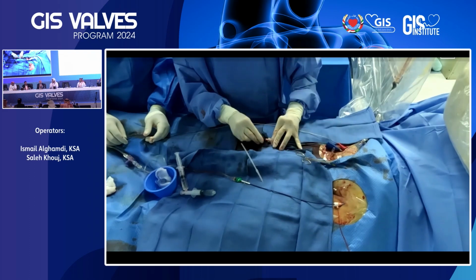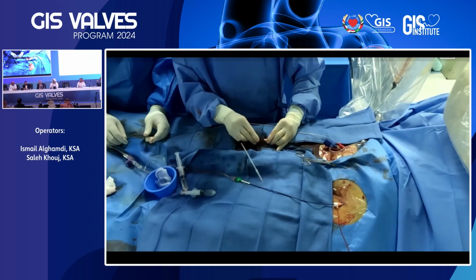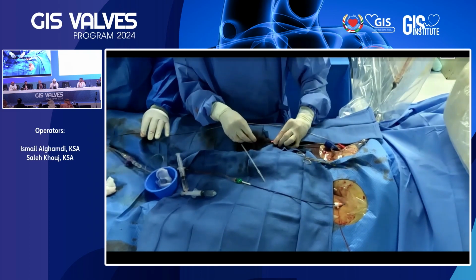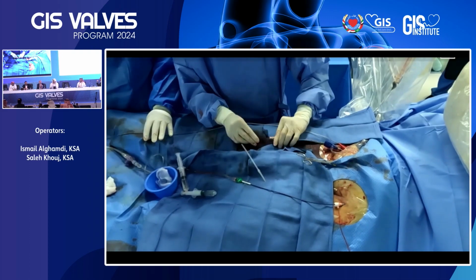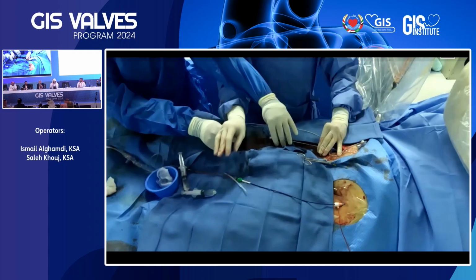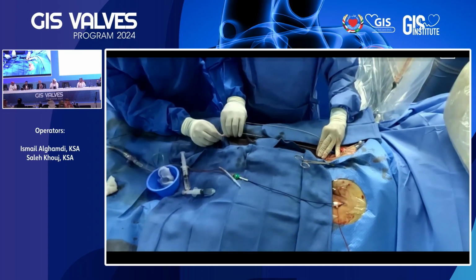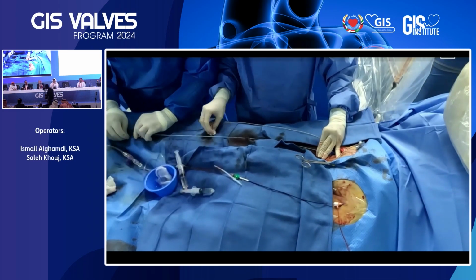Done correctly meaning that you have to have a proper measurement of the LV outflow tract by echo, because a lot of the time it's underestimated. You have to have a good measurement of the continuous wave Doppler along the line of the aortic valve ejection. And if it is all correct, like in this patient, we have to think why.